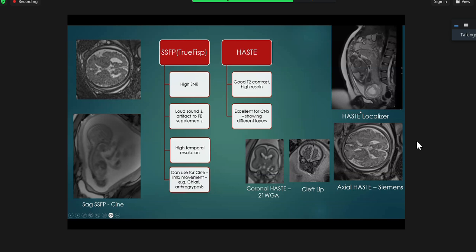And then this is what I'm talking about, the general localizers to see the lay of the land, see where the location of the placenta is. I also double check any issues with mom. And then you can give a gross overview as to where the placental margin is compared to the internal os. Obviously, in the second trimester, that has time to move. If it's low, even in the second trimester, it can go up. So there's a lot of value in that.